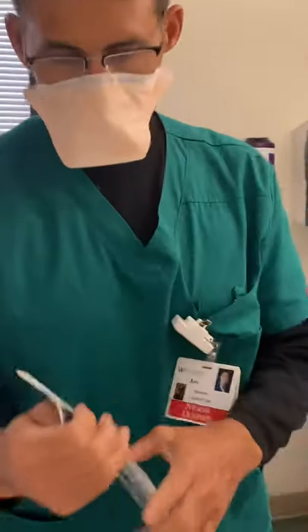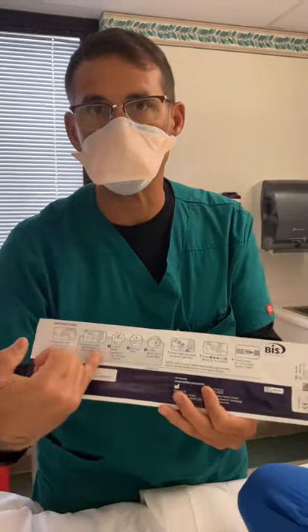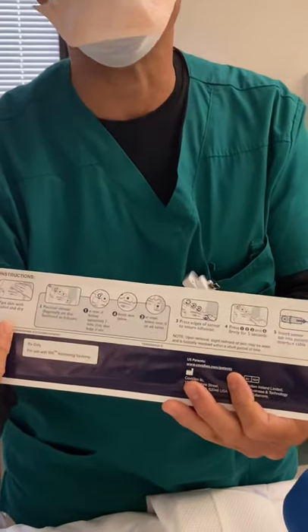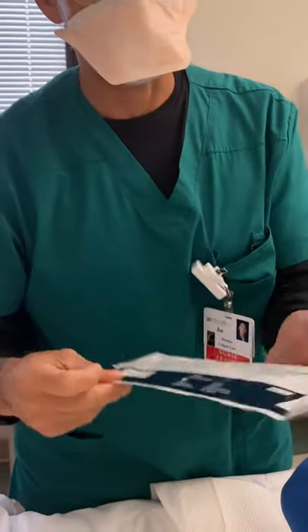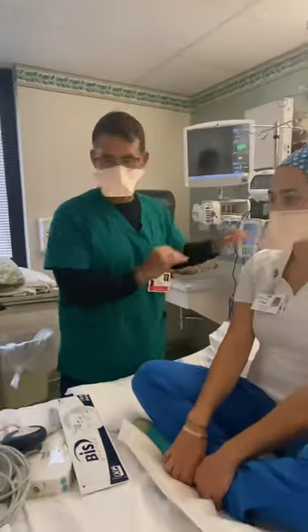I'm going to go over it, but if you need a reminder, all the instruction on how to place the leads is right here behind the packet. Megan is going to be our subject today. You can go ahead and lay back.